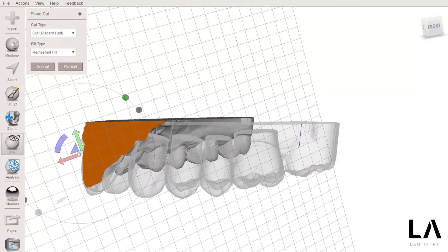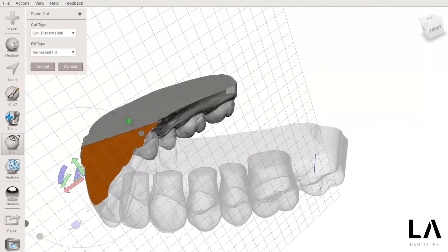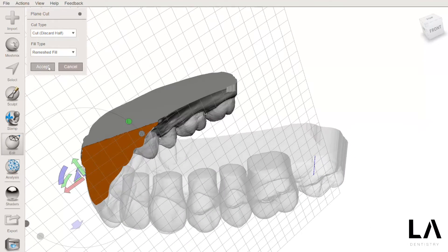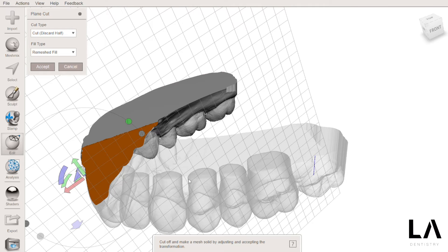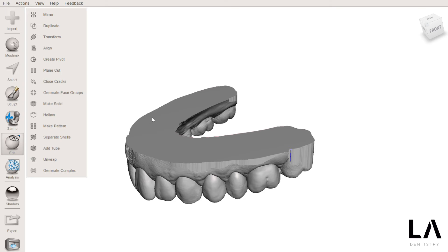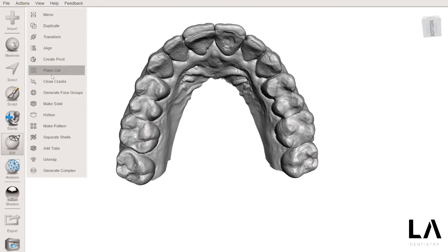I will spend a lot of resin trying to print it like this. So what I'm going to do — I don't want to accept this, I will do Control Z. Now I'm going to go to Edit and click on Hollow so that I can make my model hollow.